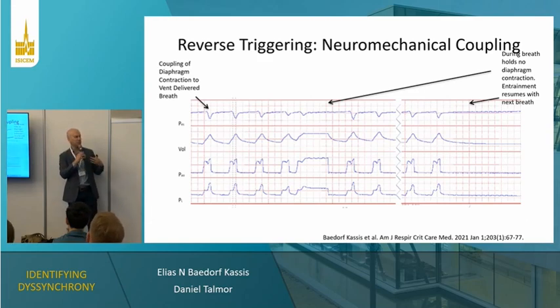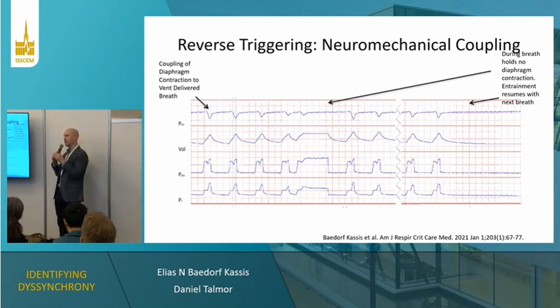We all do this probably without even thinking about it as we are running, walking, and even if you've ever done a demonstration of putting yourself on the ventilator, we may actually make it easier to deliver that breath by unconsciously coupling our breath to the ventilator itself. And in a pathologic state, you see this discordance between a tightly coupled and coordinated activity and a discoordinated activity that may be more removed and delayed from the actual delivery of the breath.